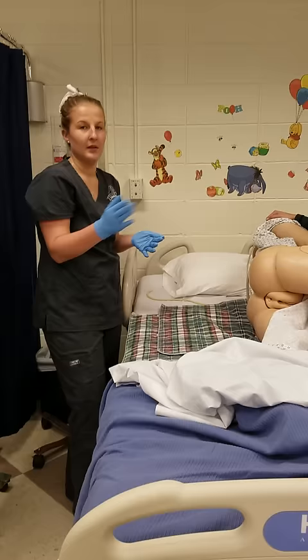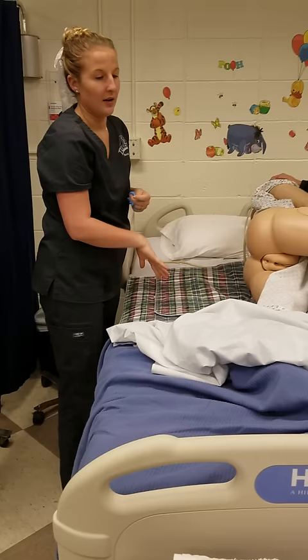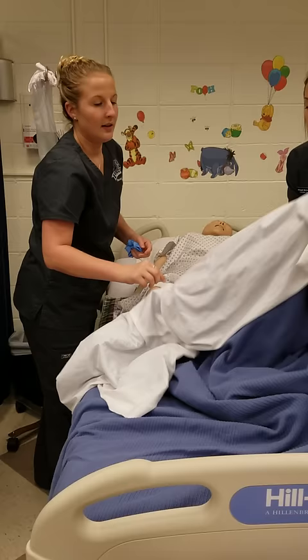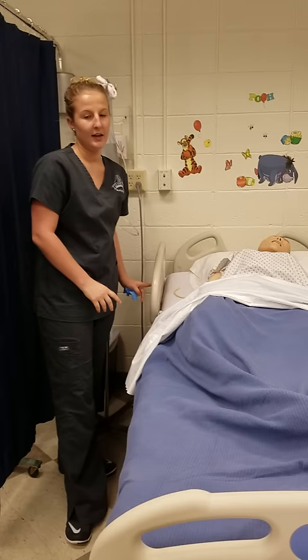I would perform hand hygiene and lower the bed to the lowest position. I would roll them back over and lower the bed back down and give them the call light. I would leave the room until they needed to go. Then I would document my enema, and that's all done.